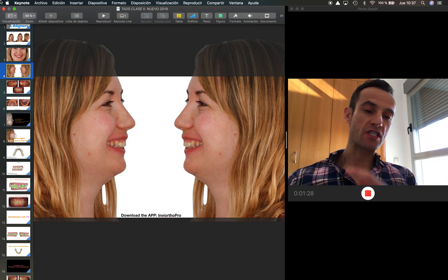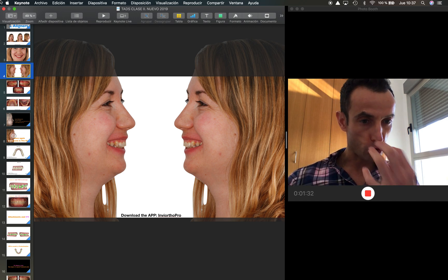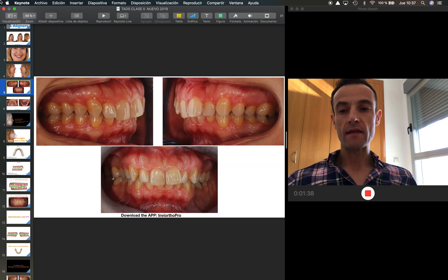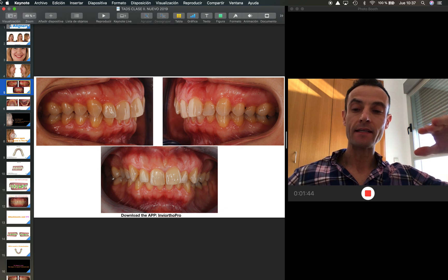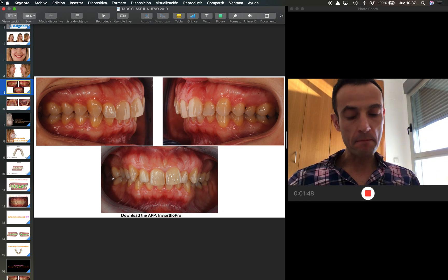As you can see, she presented a narrow upper arch where the teeth in the front protruded. The idea of this case is to solve this severe Class 2 — as you can see here, the occlusal plane is also canted. The bilateral Class 2 and the deep bite.